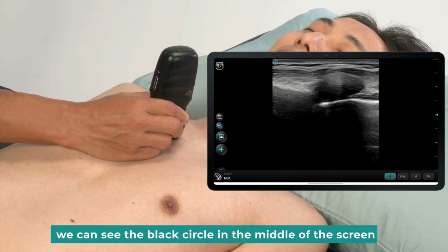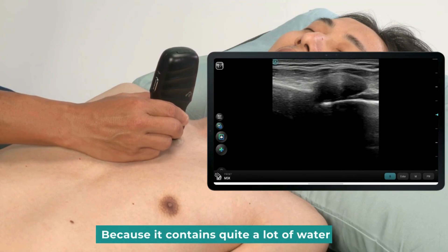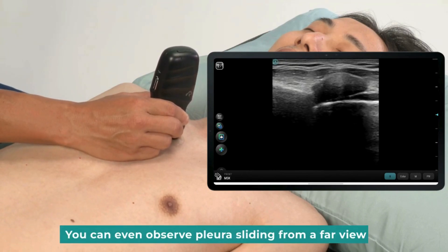We can see a black circle in the middle of the screen. This is the cartilage we're scanning, because it contains quite a lot of water. The image is penetrated to the bottom. You can even observe pleura sliding from a far view.